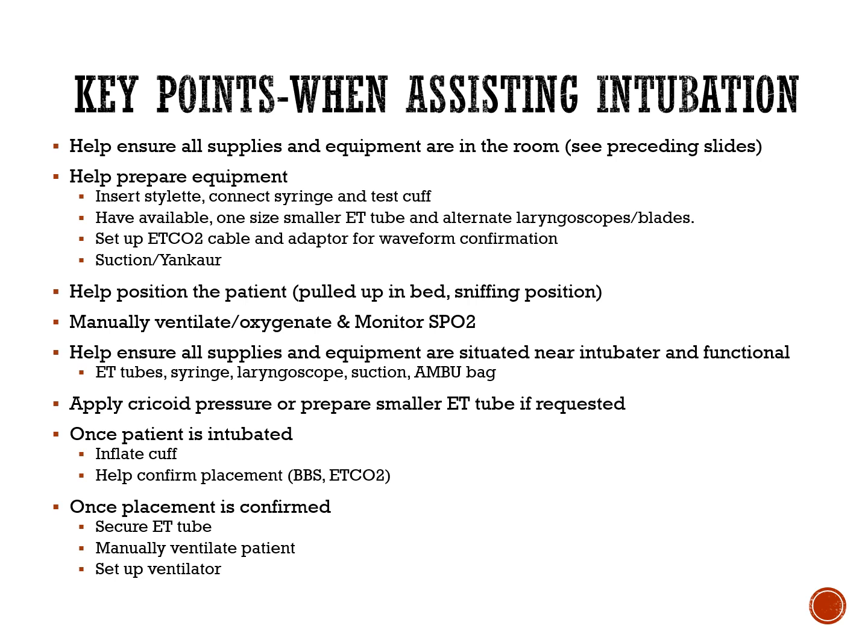And then, help ensure that all supplies are situated appropriately, as I just said. Apply cricoid pressure if asked to, or prepare a smaller size ET tube, again, if it's requested. Once the patient is intubated or we think they're intubated, inflate the cuff, help confirm placement. End tidal, give the patient a listen over both lungs as well as the epigastric area, as somebody appropriately squeezes the Ambu bag.